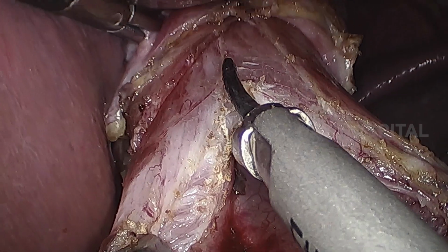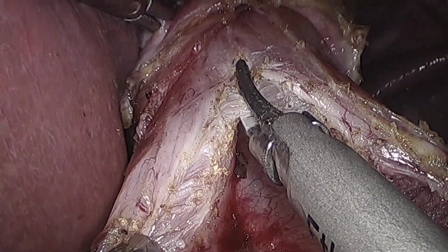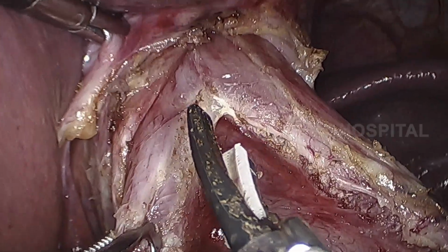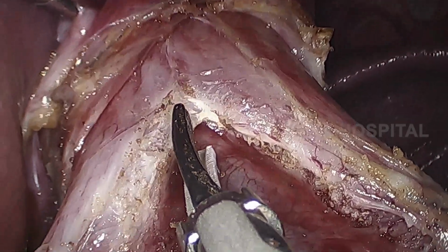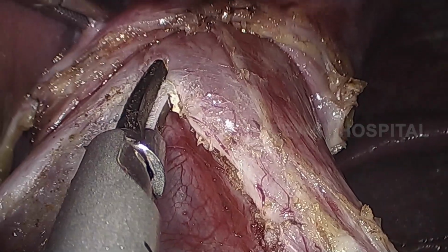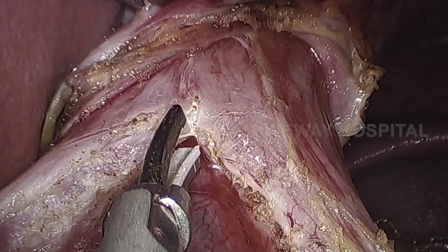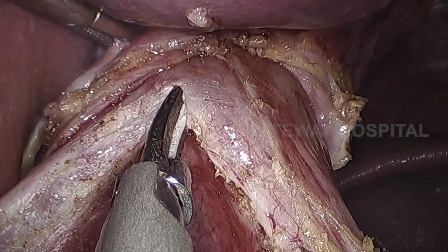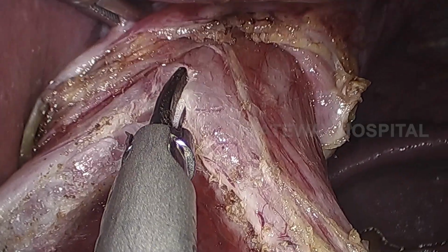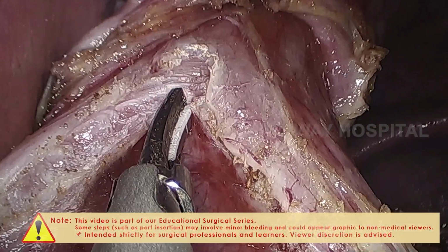This same myotomy can be done by using two curved dissectors on either side. You can tear the muscle fiber and you can go gradually cranially. The only disadvantage is it will cause a lot of oozing, and once there is oozing or bleeding in this area, the entire anatomical plane will be obliterated and you will find some difficulty in identifying the proper planes.